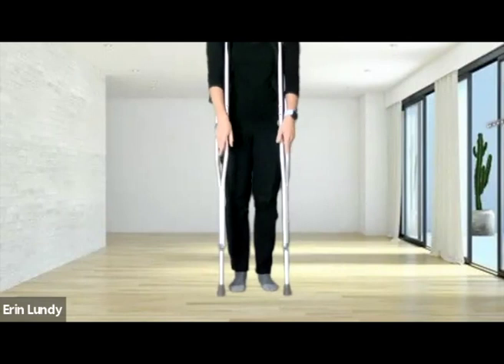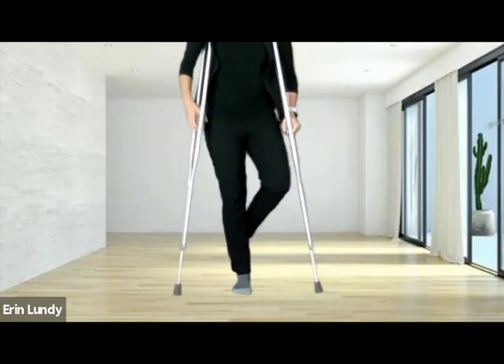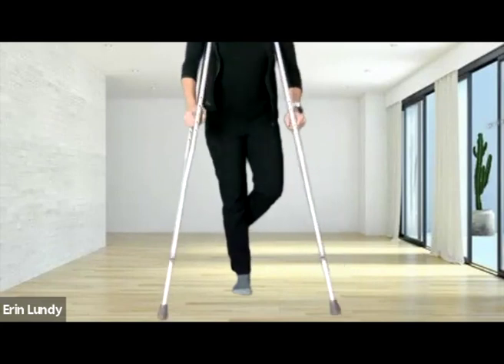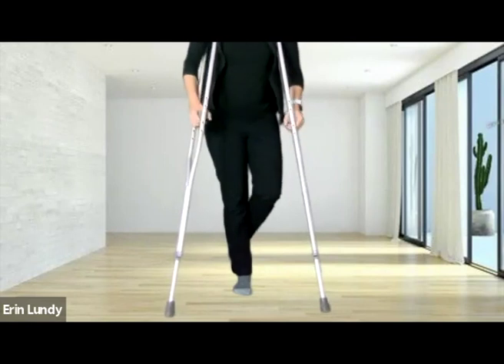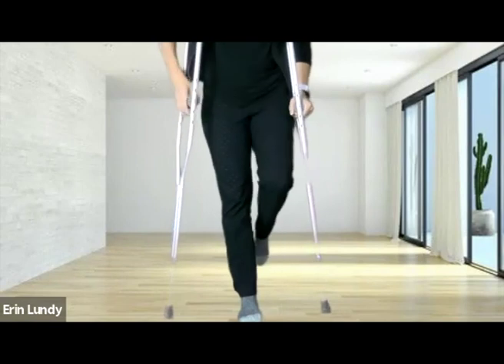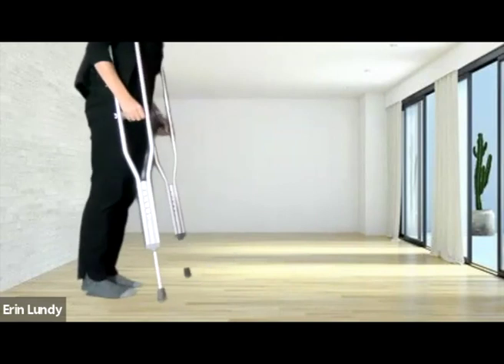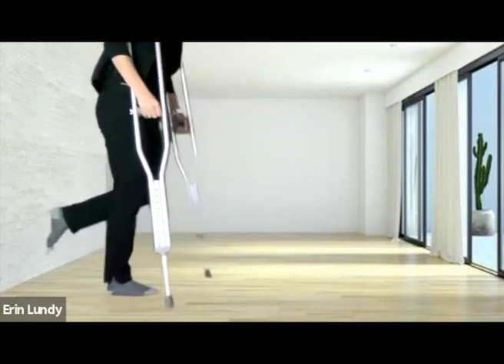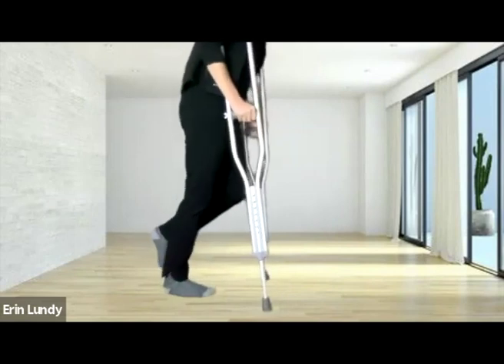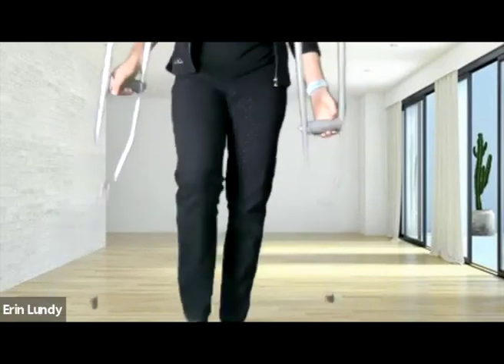So you've got your 2 crutches on the ground, and let's say that this leg is my injured leg. I'm going to put 2 points forward with the crutches and then swing my leg up. This is my non-injured leg, this is my injured leg. 2 crutches, swing forward. And I'll show you that from the side as well. Standing here, bring up your hurt leg, put 2 crutches forward, bring forward, 2 crutches forward, bring forward. You'll note, again, this is a really simple, easy way to do it. The closer your little steps are, the easier it is for your kid.